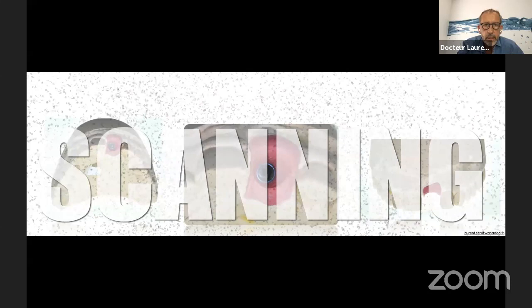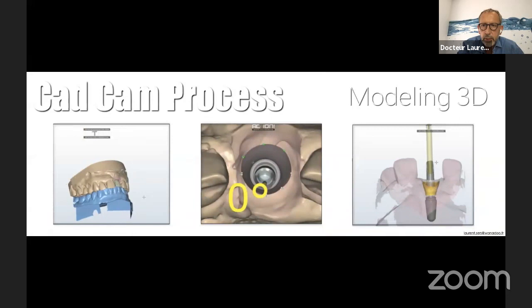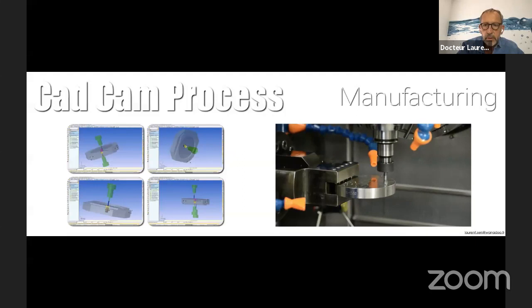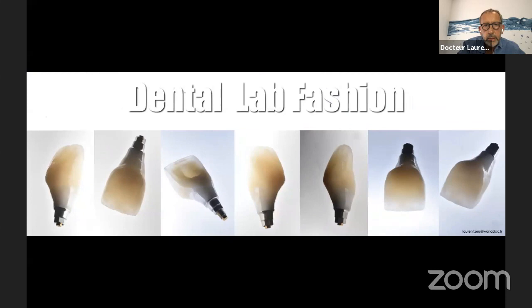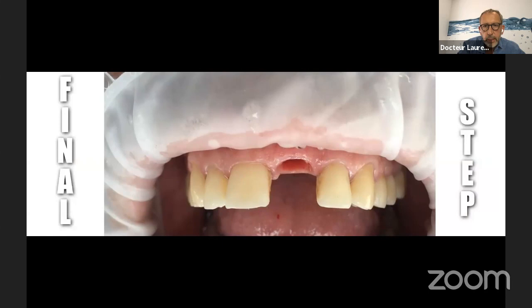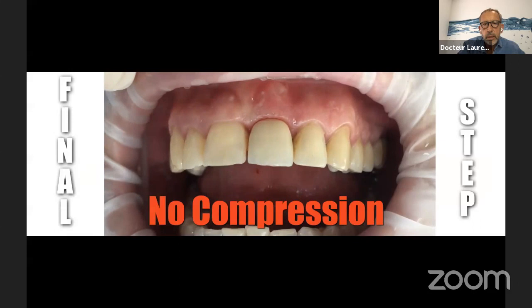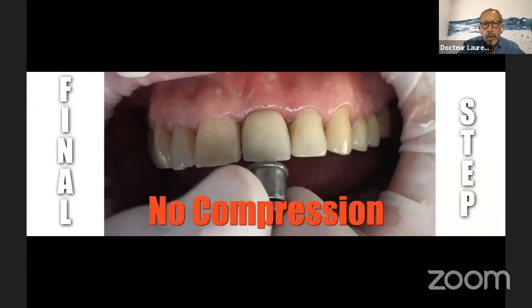After scanning, it's the CAD/CAM process — modeling of your emergence profile. You have to check with your dental technicians the perfect compression or not, as you want. Then it's time for manufacturing — and this is the dental lab finishing in ceramic. At the final step, I put the tooth and you can see we have no compression — the gingiva doesn't blanch. No compression, just screw, put the tooth, and screw. Now you can see the perfect integration of the tooth.